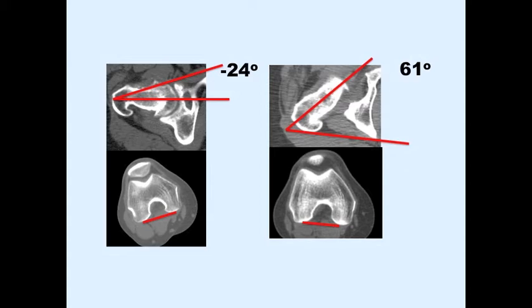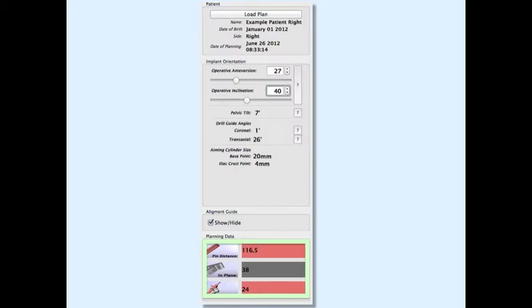If significant residual anteversion deformity is accepted on the femoral side, the cup orientation goal can be altered by the surgeon accordingly. Once the desired cup orientation is determined by the surgeon, you will see the necessary adjustments for the HipSextant instrument in the lower left-hand corner of the viewer screen.